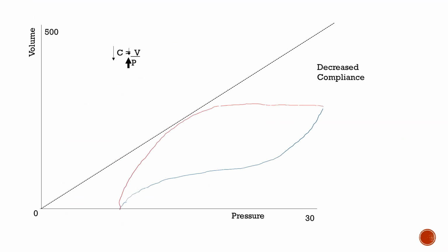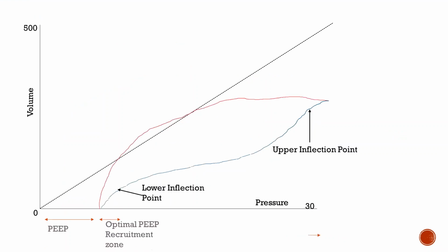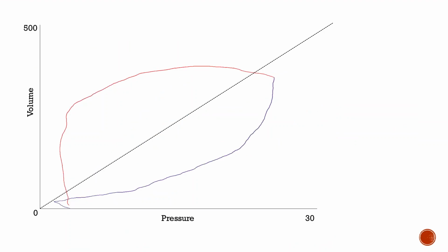And this one. The increased compliant loop was this one. Oh. I'd have to say this is somewhat of a normal compliant loop, but there's something weird or different about it. What's different about it? You already know all the answers. You can do the next one.